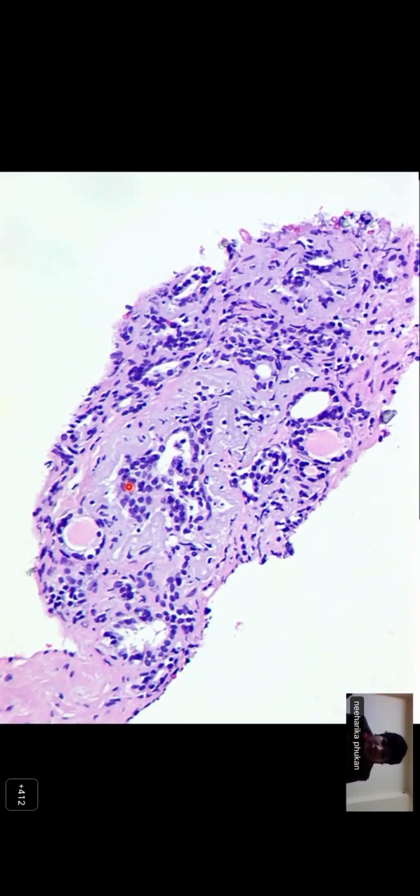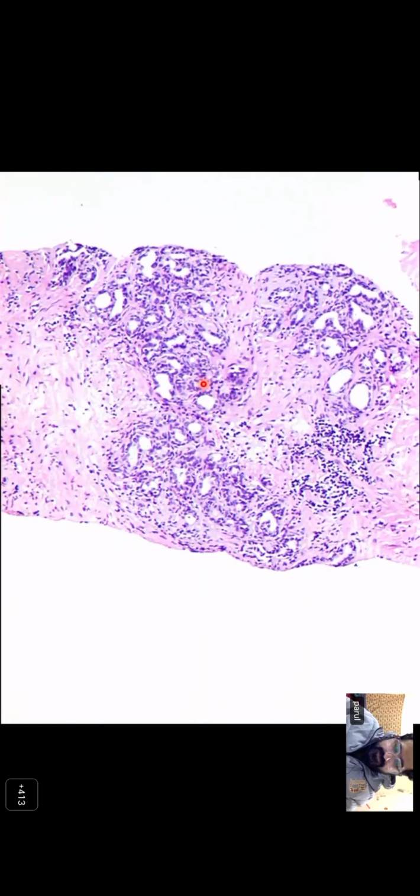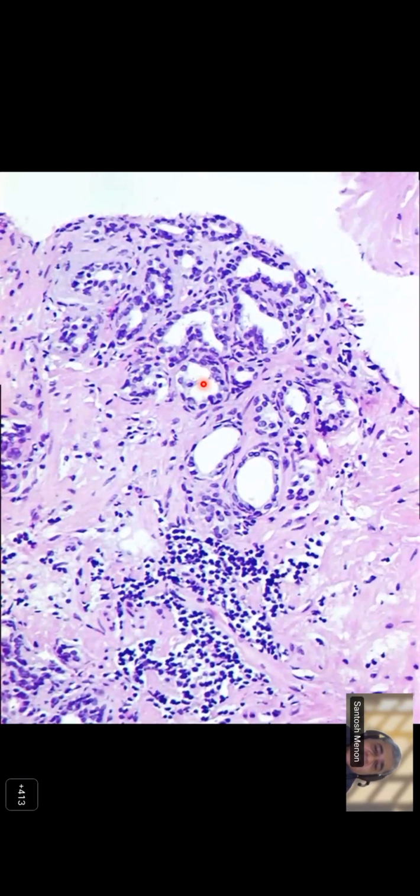Do you think these are fused glands? Yes. Okay. Are they pale looking glands, or are they blue looking glands? Let me put the question like this. So you said they are not normal glands. Fine. They are not large normal glands with foamy or clear cytoplasm. Do you see the cytoplasm of the cell? Is it a prominent cytoplasm? Do you see prominent nucleoli at this power or this power?